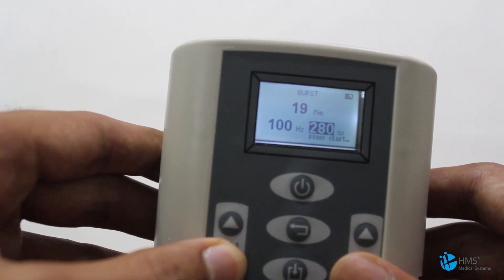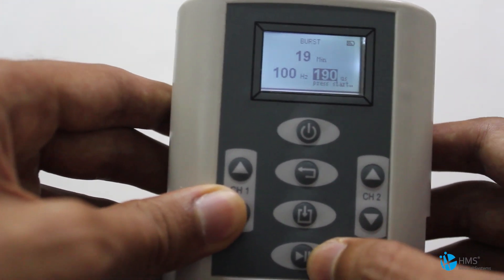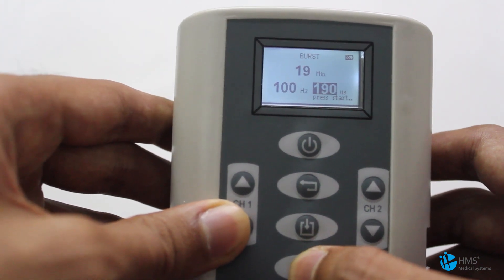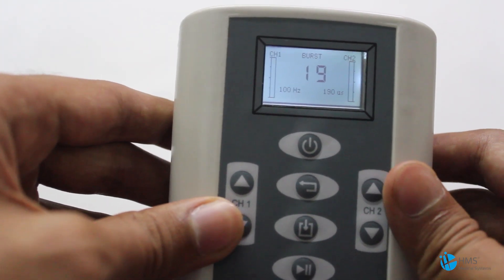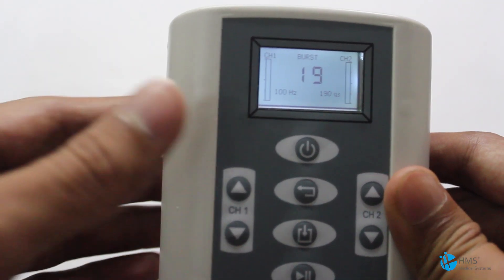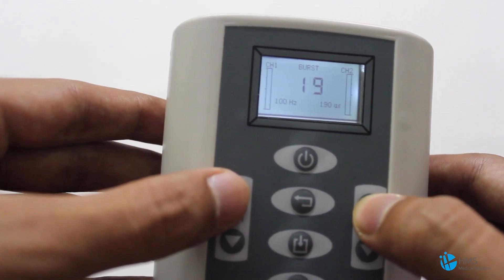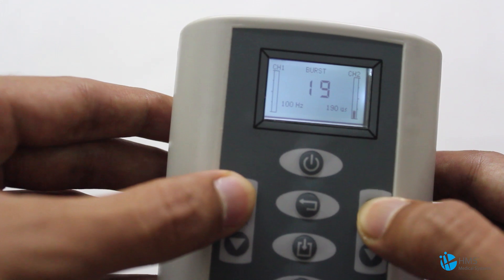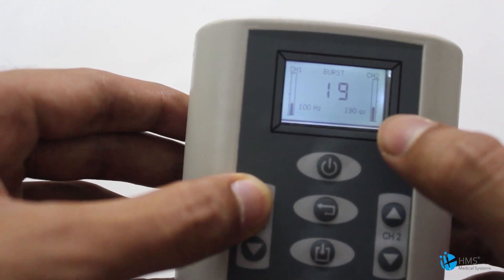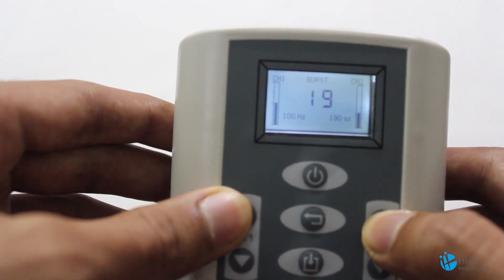The minimum pulse width is 20 microseconds. After setting this, press the Start button at the bottom. The output will be given through those electrodes, and these two buttons can now be operated for intensity. These bars indicate the level of intensity.